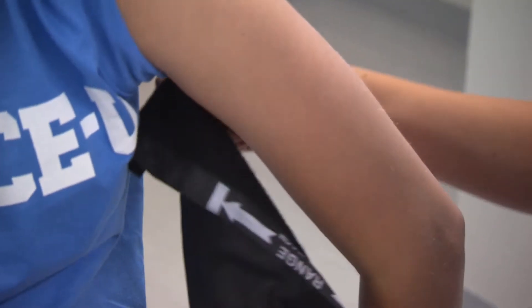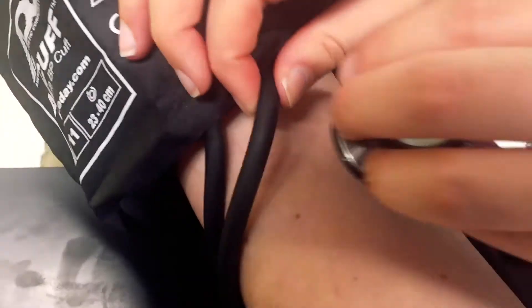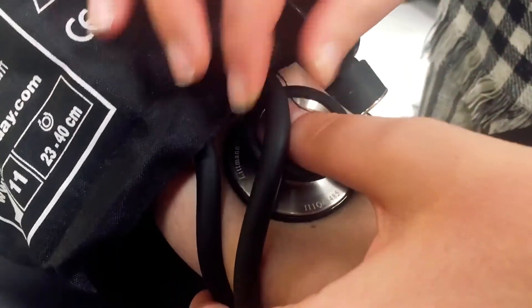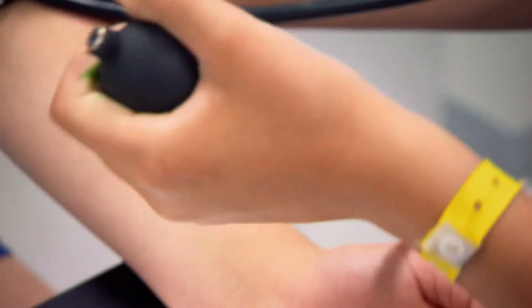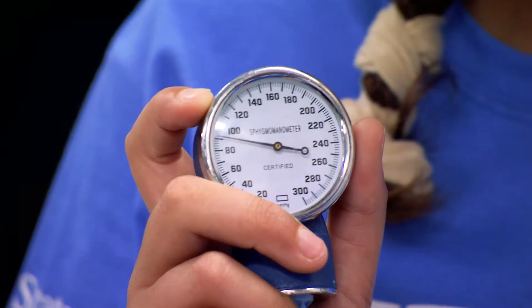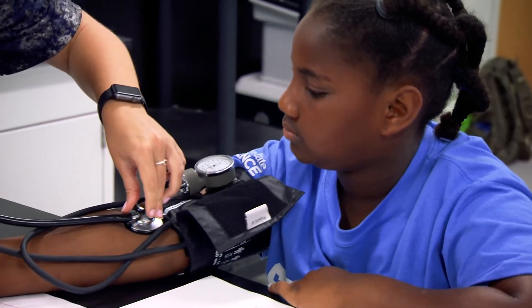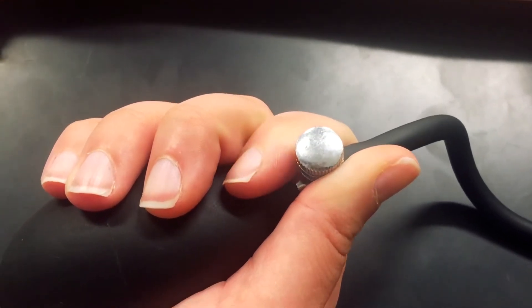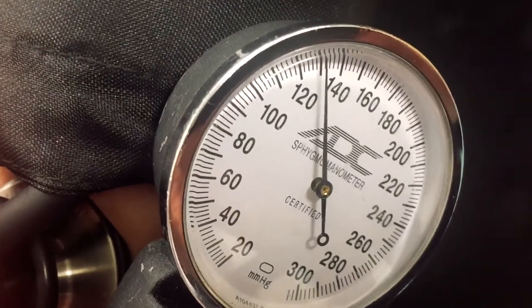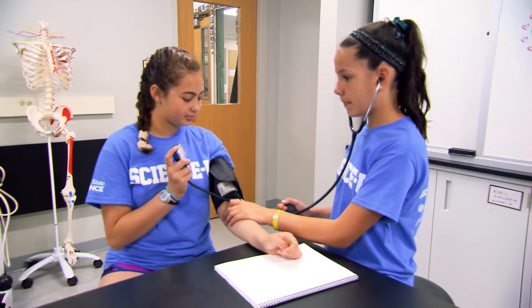Here's how to take someone's blood pressure. Wrap the cuff around your patient's arm and snug it up with Velcro. Then place your stethoscope in the crease of their elbow to hear the flow of blood through what's called the brachial artery. Squeeze the inflation tube to pump up the cuff to about 140. As it tightens, the pressure cuts off the flow of blood to the brachial artery. Then you open the valve to release the pressure on the cuff so the blood starts to flow again. Watch and listen. When you hear beats, look at the meter and write down that number — 115.